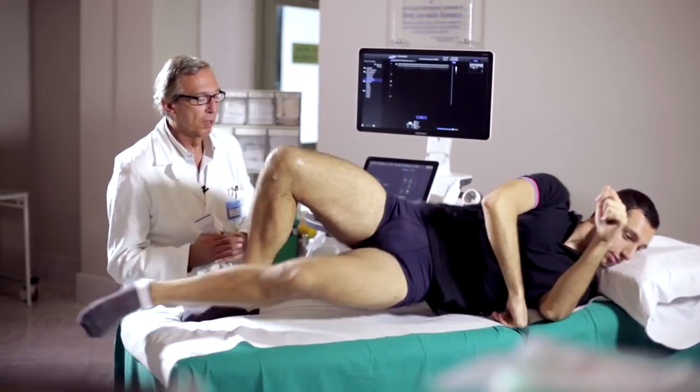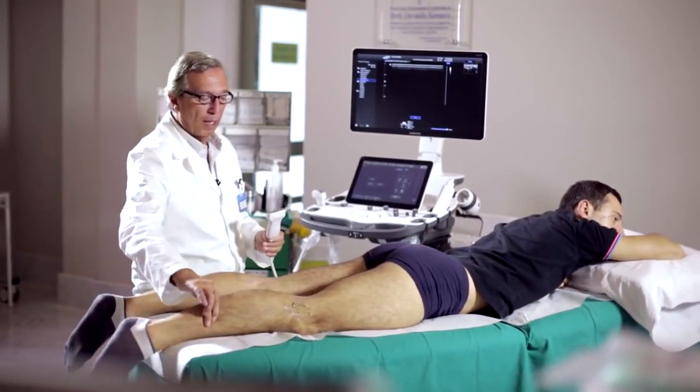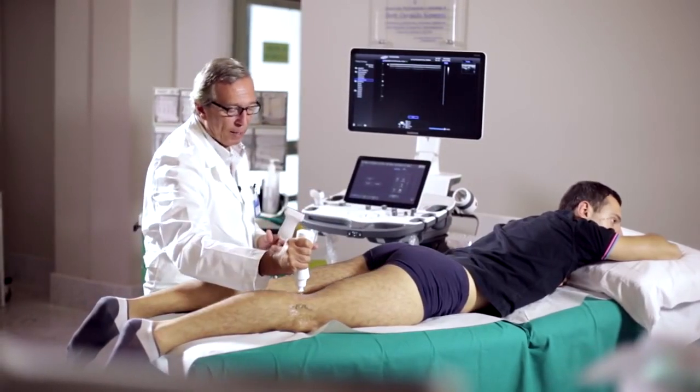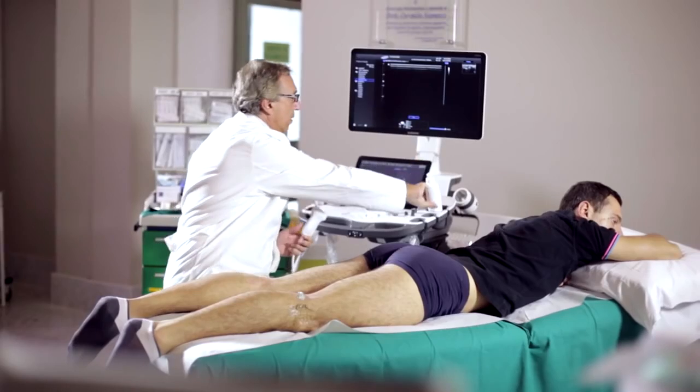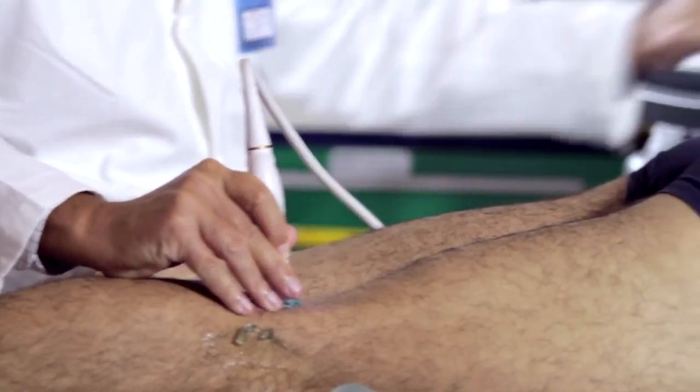Now we shall look at the last compartment, which is the posterior compartment of the knee. We will ask the patient to lie on his stomach in order to be able to scan this area. We will initially use axial scans. This allows us to find some very important structures.